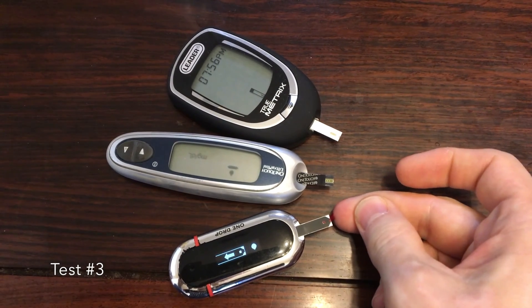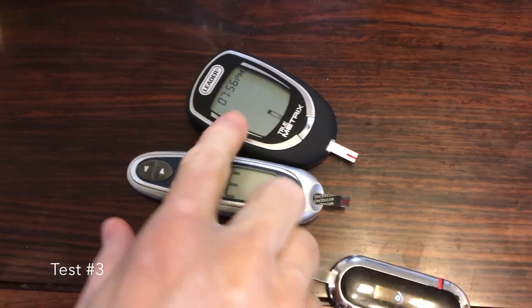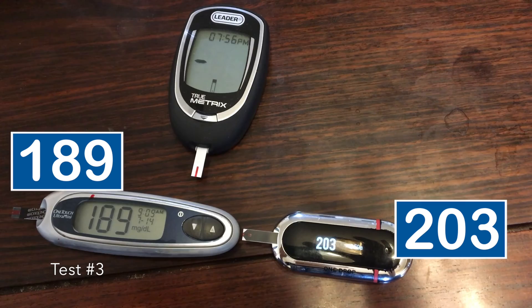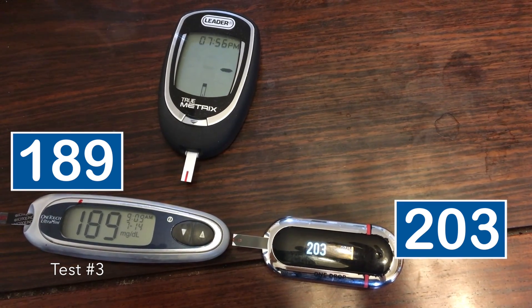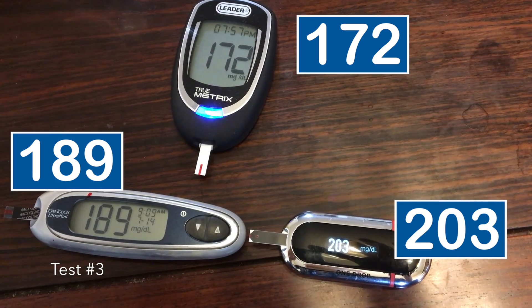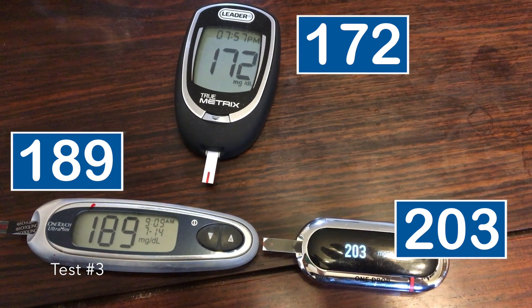The third and final test. OneDrop: 203. OneTouch: 189. TrueMetrics: 172. Bigger gap between the Ones this time, but not one that would change my insulin dosing. The TrueMetrics might, though — 203 is quite a ways away from 172, and that might mean the difference of one unit of Humalog.